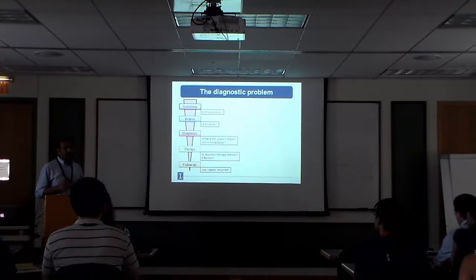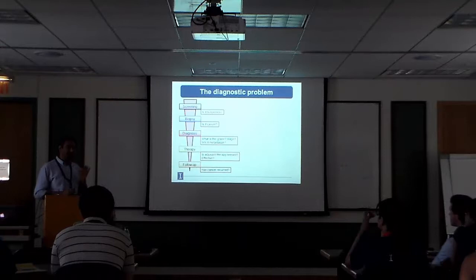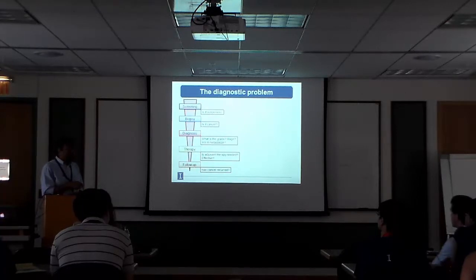So there's a fairly, I would say, almost primitive analysis at this stage where you just blindly go and take some things out in some cases. And even in cases where it's directed by imaging, you can't really see locally. So oftentimes you sample multiple times and so on. So 1 million people, anywhere from about 5 to maybe 50 to 100 samples per person at this stage. Then somebody has to look at all of that and come up with a diagnosis. And they have to say this is cancer or no cancer to begin with.